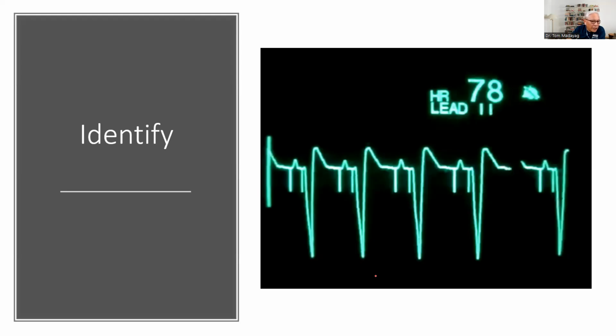In this particular situation, you have two electrodes, one stimulating the atria and the other stimulating the ventricles as well. This is what is known as an AV sequential pacemaker.